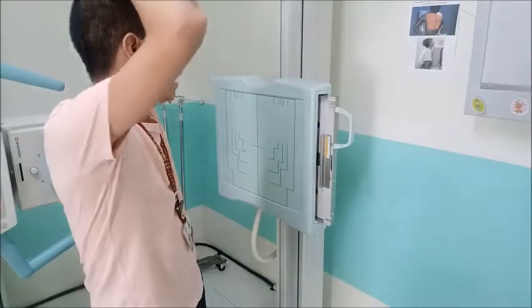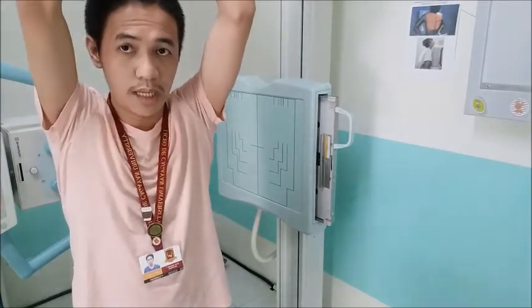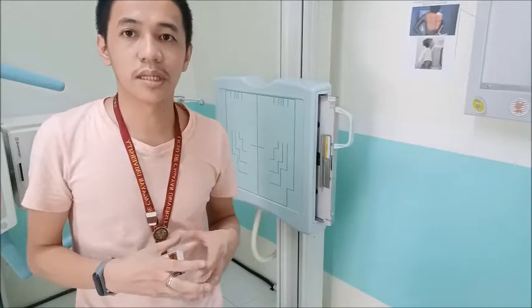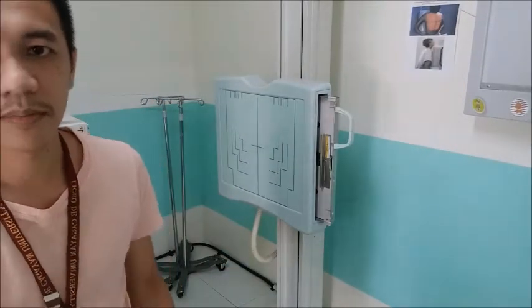Okay, you can have one of the family members of the patient hold the patient's hands raised. But since we are in the Philippines, it is very rare to have a Pigg-O-Stat here. Remember the Pigg-O-Stat, the device that holds pediatric patients during the chest examination. We do not have that here. What we do is have the family members hold the patient during the examination.